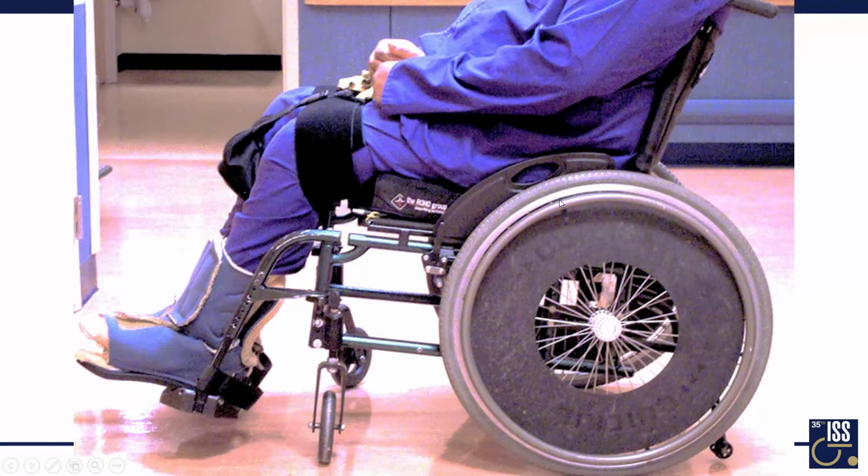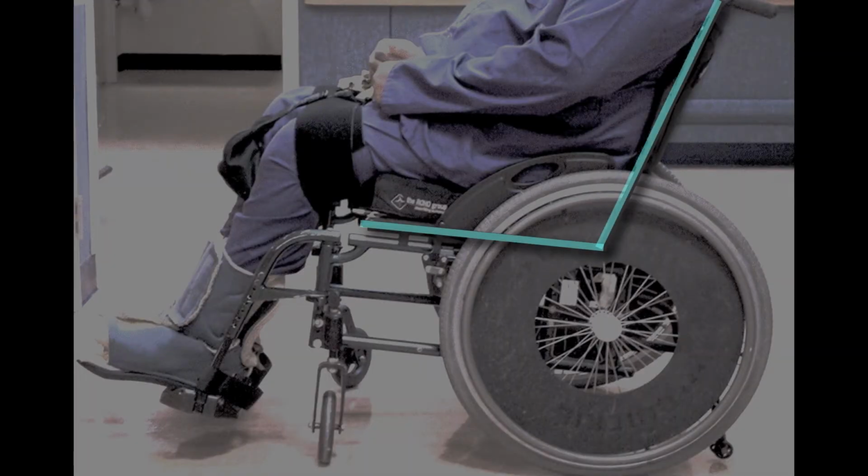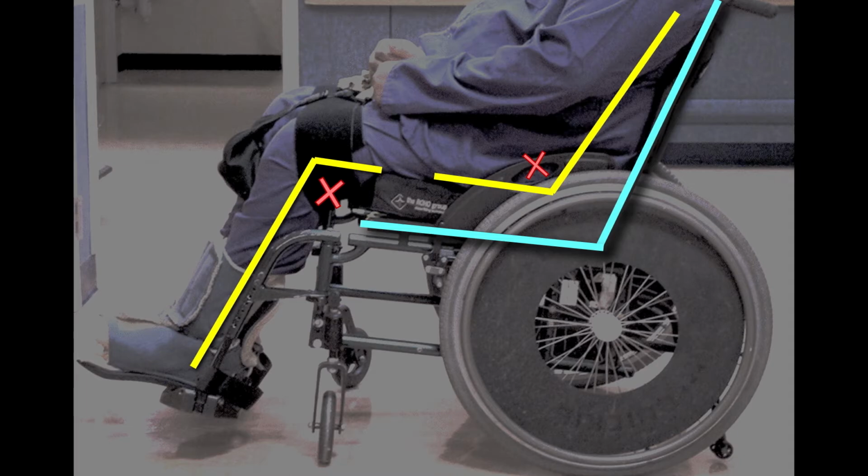Okay, and this is a case where if we don't look at these things, then we can do serious harm to our patients. This is a gentleman who had, I think, a mid-thoracic injury. He's over 300 pounds. And he had HO, pretty severe in both hips, and contractures in his knees. He went through a number of different VAs, and each time the only real option you could get easily was a Quickie 2 with an angle adjustable back, and he was a little bit over the weight limit.